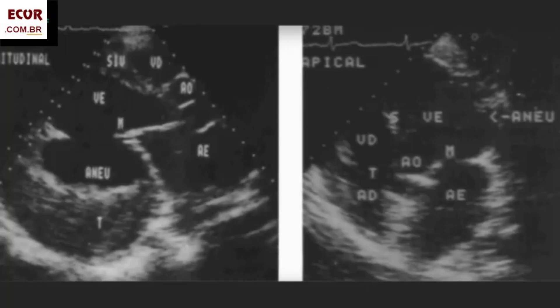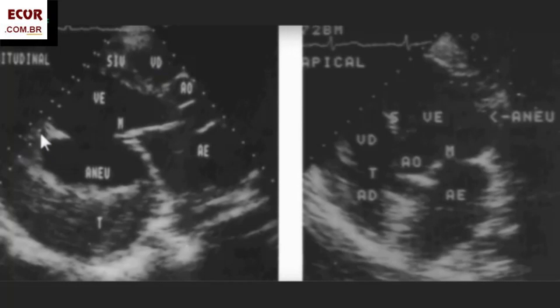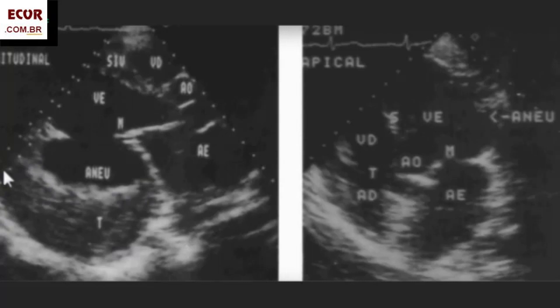Here is another example. It can involve any wall of the left ventricle. Here in the posterior wall — posterior lateral wall. There's a thrombus inside the aneurysm. Here's the thrombus, here is the wall — thin. And it was dyskinetic.